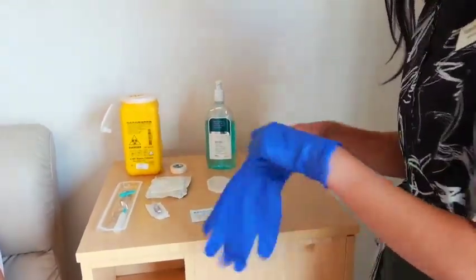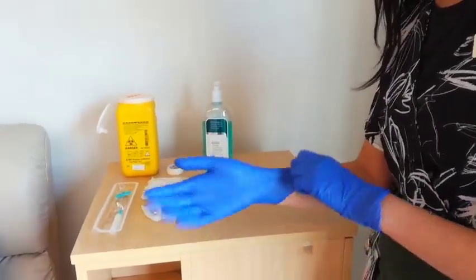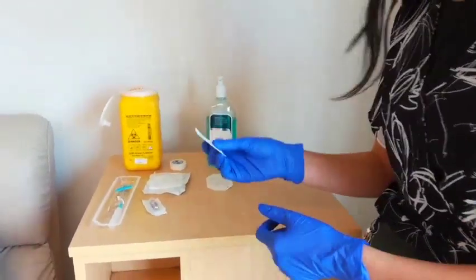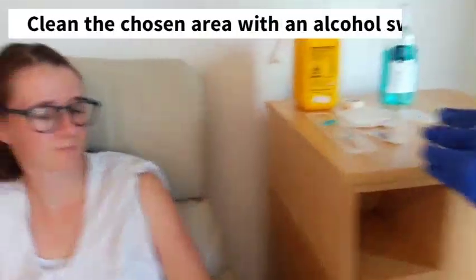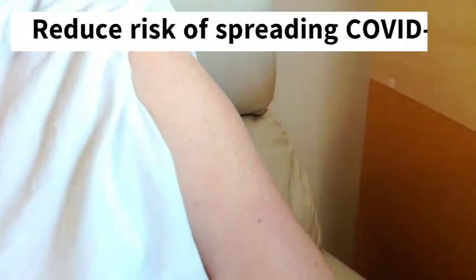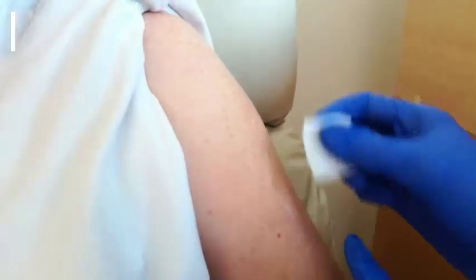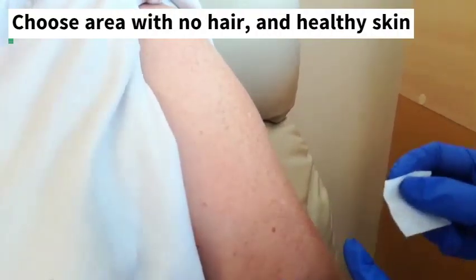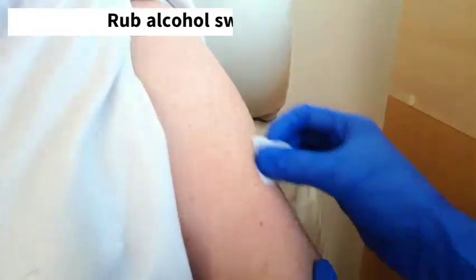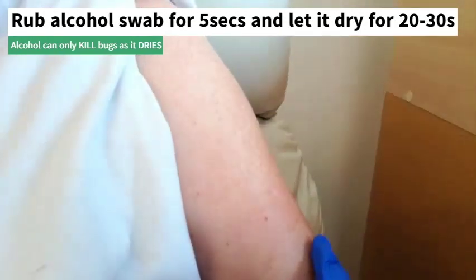Now that we've got all of our equipment set up near the patient, we can come to the area that we'll be putting the subcutaneous line in. We'll get our alcohol swab to clean the area. For this video, we're going to use the arm, but like we said earlier, try for the thighs and for the abdomen if possible. Go for an area that doesn't have any hair on it and that the skin is looking good, then rub for a few seconds and let it dry.